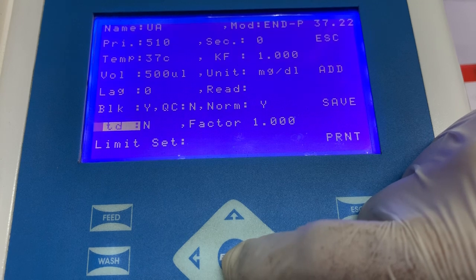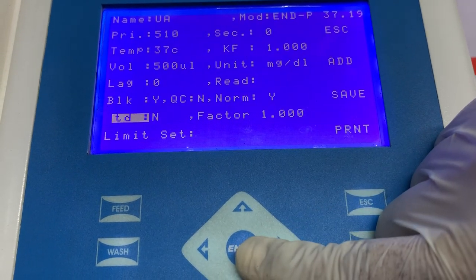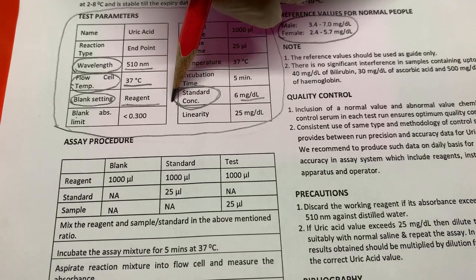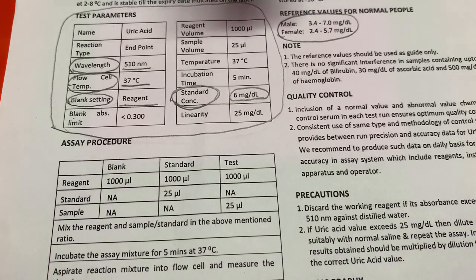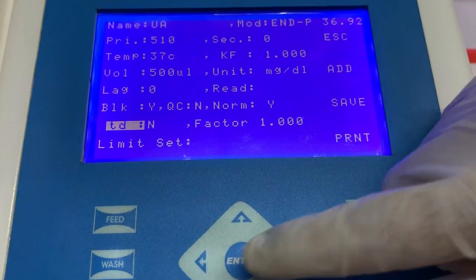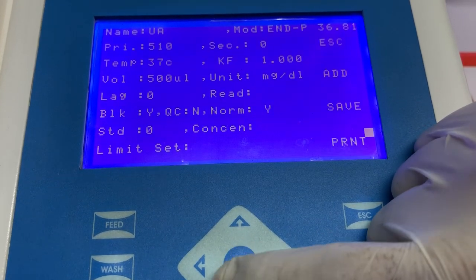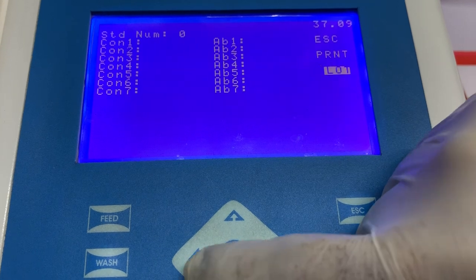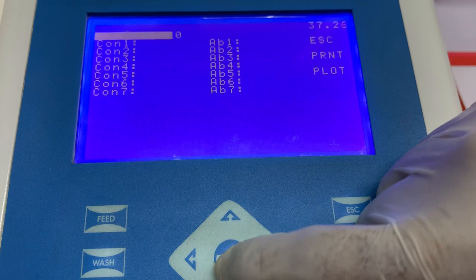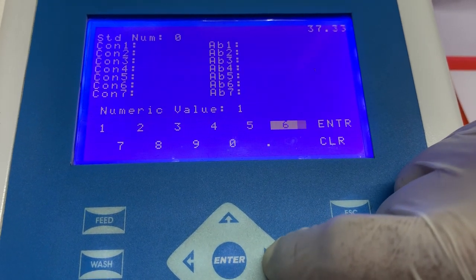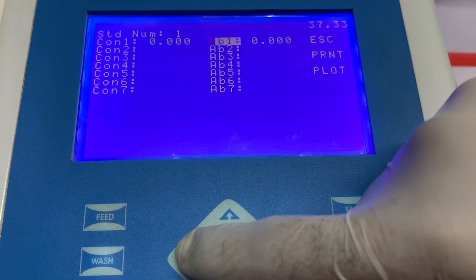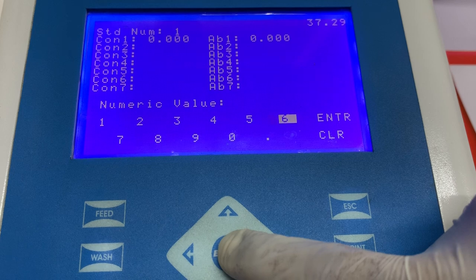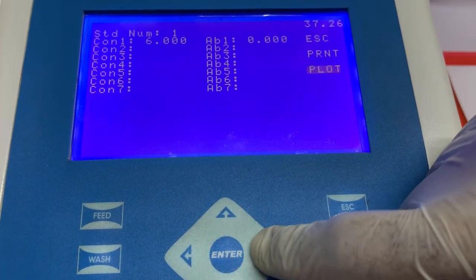Next, you have to enter the value of standard — whether the standard is available in the kit or not. This information can be seen in the instructions for use, where the manufacturer clearly mentions whether the standard is available in the kit and, if yes, what is the concentration of the standard. Here, select the option of standard and select yes because the standard is available in the kit. Next, we have to enter the concentration of standard. First, select the number of standards available in the kit. In this case, only one standard is available, so select option one. Now the option to enter the concentration is open, so enter the value of concentration. Press escape to come back to the home screen.